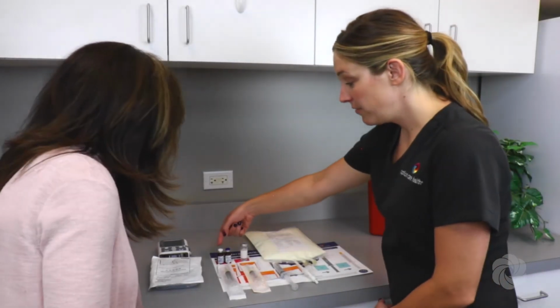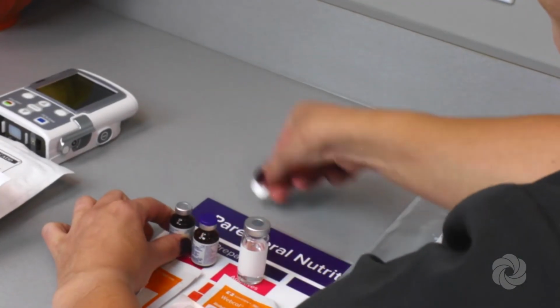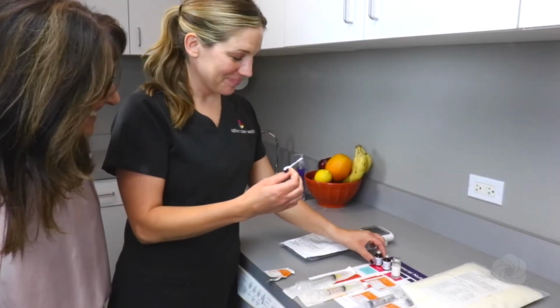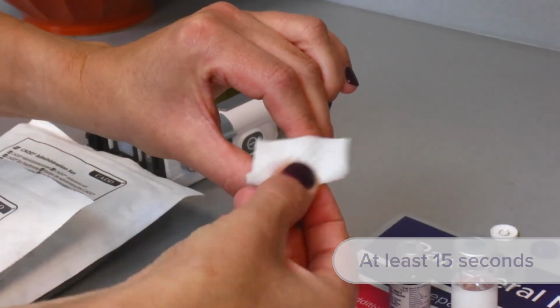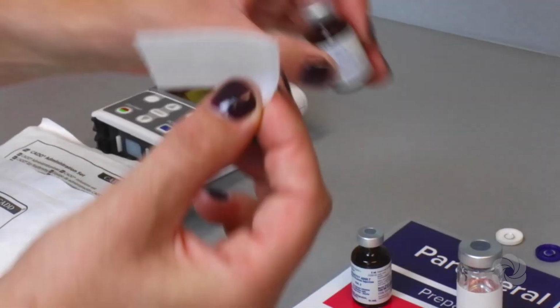Locate the 2 vitamin vials on your PN preparation mat. Remove the protective caps from the 2 vitamin vials. Scrub the rubber stoppers of the vials with an alcohol wipe for 15 seconds and allow to air dry. Do not use a vial that is missing a protective cap. Promptly call us.